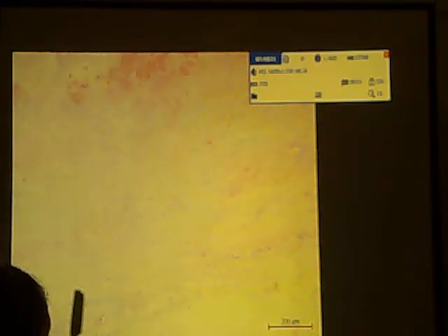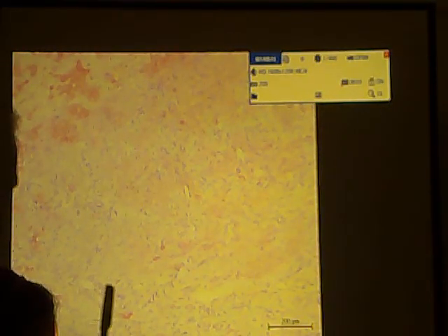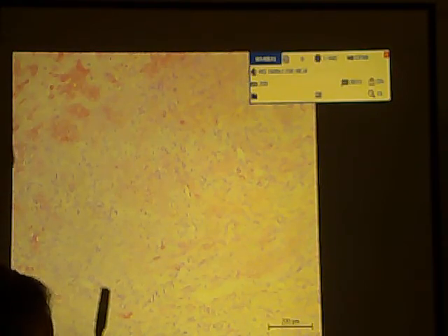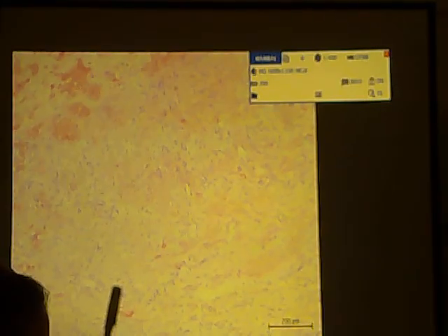So, what type of inflammatory cells would you see? So these are your scattered inflammatory cells, particularly. I heard lymphocytes earlier. Isn't this acute? So going back to the basics.